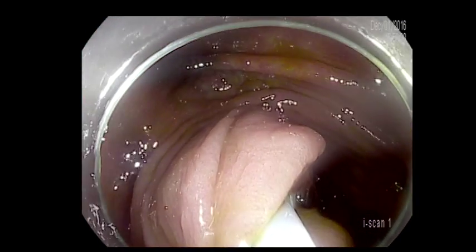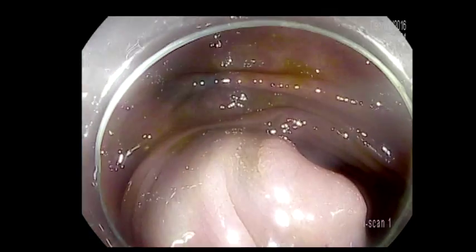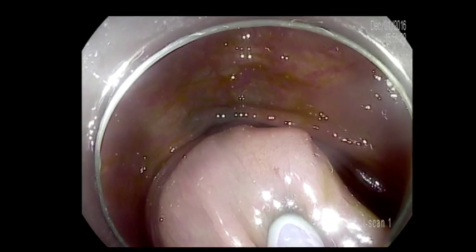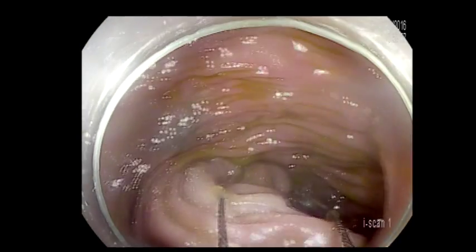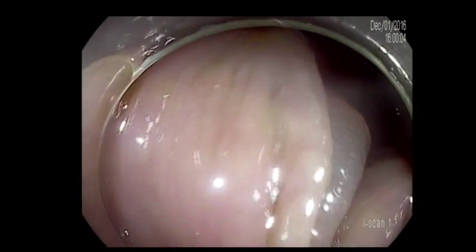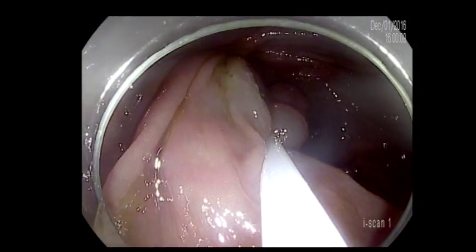In an attempt to do a resection of most of the lesion in one piece, which I don't think was a good idea because of the shape of the lesion. It's a C-shape, and the more you inject, you are creating a valley in the middle. And that's exactly what happened here — when I'm trying to close the snare, I cannot get the middle part of the lesion because it is within this valley.